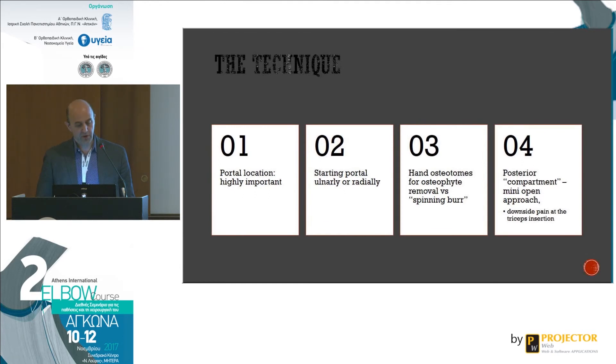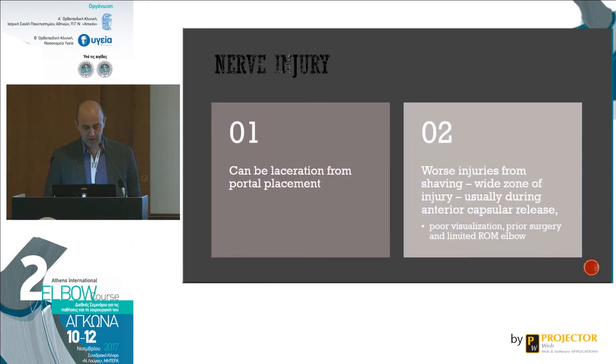To summarize about the technique: portal location is highly important, especially with low BMI patients where you can palpate structures. Starting ulnar versus radial is surgeon's preference. Using hand osteotomes for osteophyte removal is better than a spinning burr, which can traumatize tissues. For the posterior compartment, if you have problems due to fluid extravasation or significant swelling, it's not a sign of weakness to make a small incision and finish with a minimally open approach. Nerve injuries from portal placement are not the worst injuries — the worst are from shaving in the anterior compartment, which have a wide zone of injury and result from poor visualization and limited preoperative range of motion.